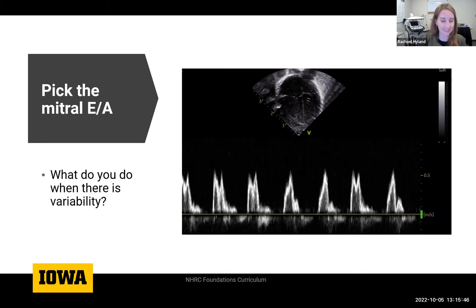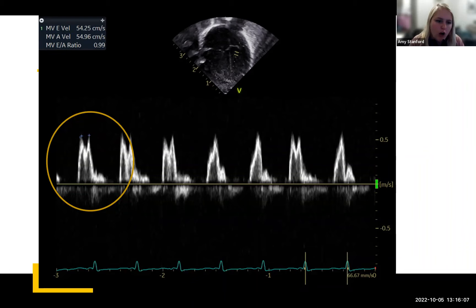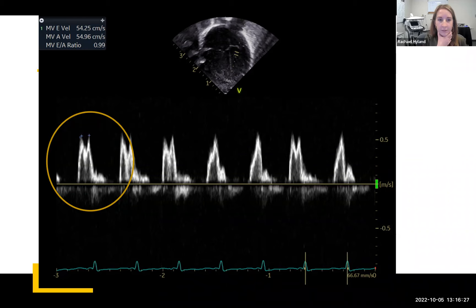When looking at a variable mitral tracing, identify the predominant pattern. If the first three beats all look pretty much the same and then beats four and five are similar but beat six looks different, the predominant pattern is those first three beats — measure those. As mentioned, especially in this view, you get yourself well aligned right when you click your Doppler button, then the baby might move a little. So often your first beats tend to be the best.